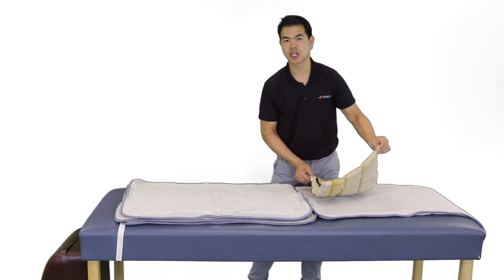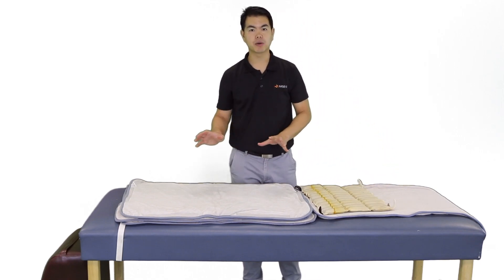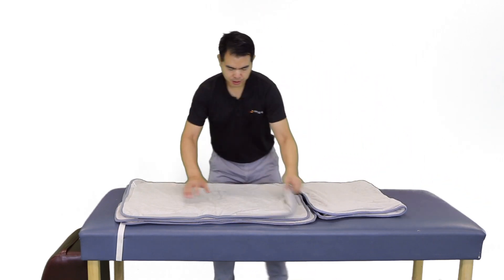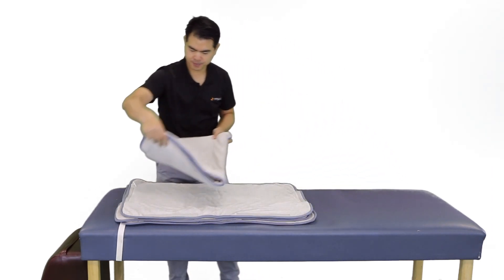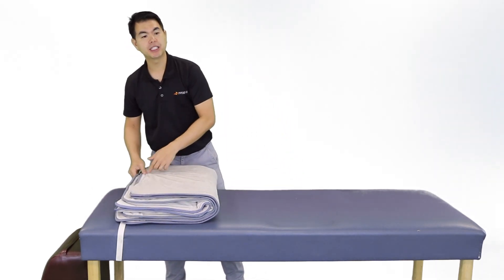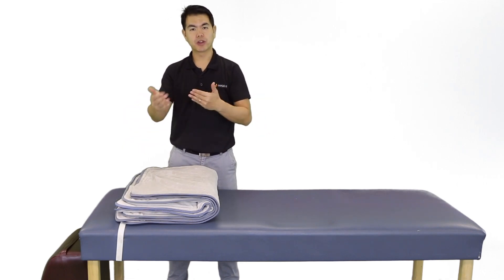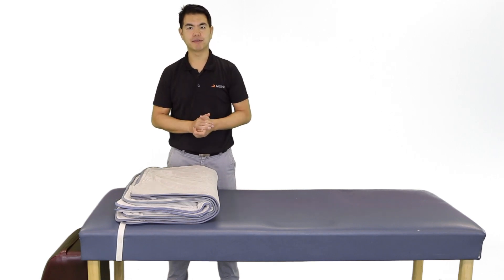After removing the hot pack from the hydrocolator, we are going to wrap it in six to eight layers of towels or three to four hot pack covers. Here we have one hot pack cover and three more. Depending on whether the patient is laying on top of the hot pack or the hot pack is placed on top of the patient, we will remove or add layers based on our target tissue temperature and the patient's comfort.